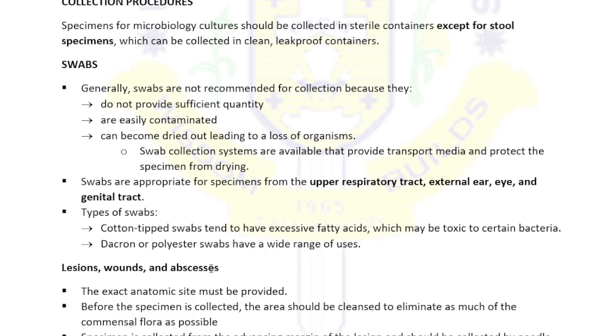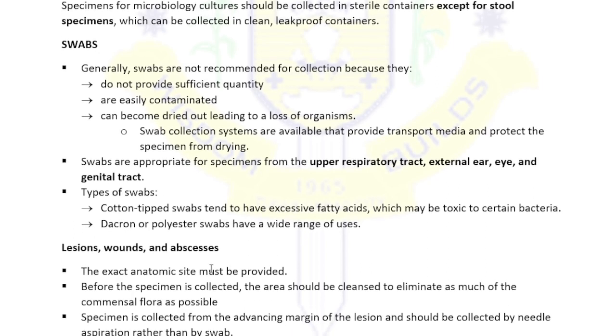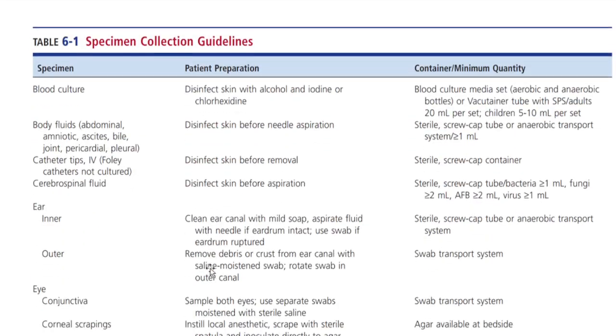Okay? So, specimen is collected from the advancing margin of the lesion and should be collected by needle aspiration rather than swab. So, for abscesses, what is usually recommended should be needle aspiration. You aspirate the abscess instead of using swab. Okay, that's the more recommended.